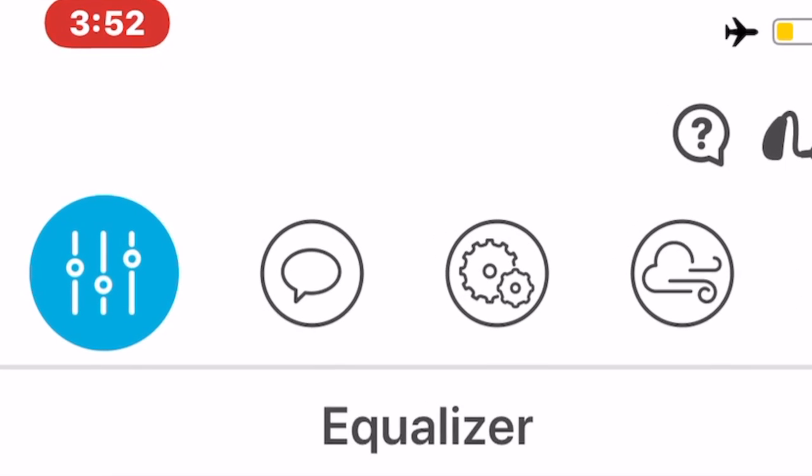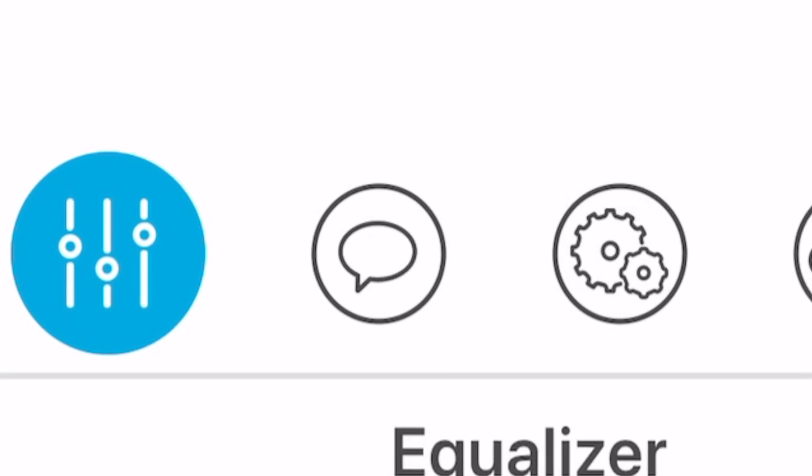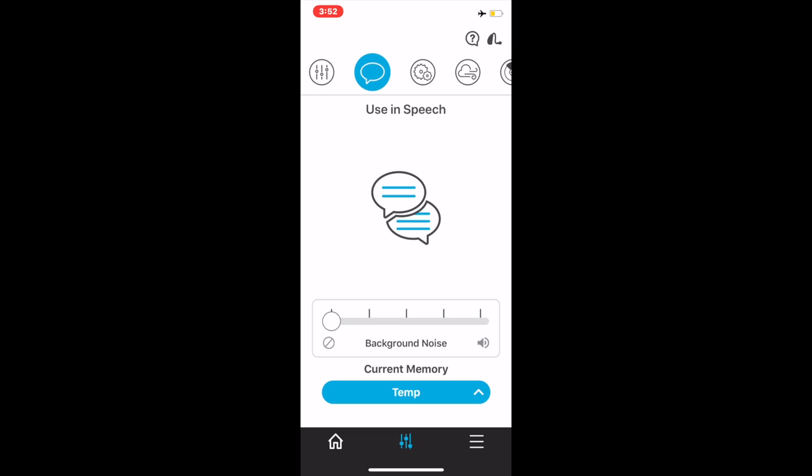Up at the top, you will see a little speech bubble. If you click on that speech bubble, this is where you can adjust the amount of background noise that is coming into the devices. By moving that circle all the way from the left to the right, you are reducing the amount of background noise and the hearing aids will provide more comfort in the environment that you're listening in.